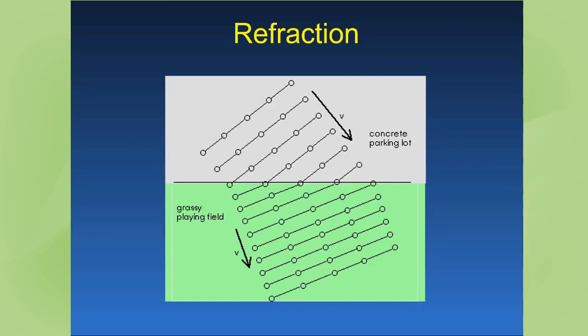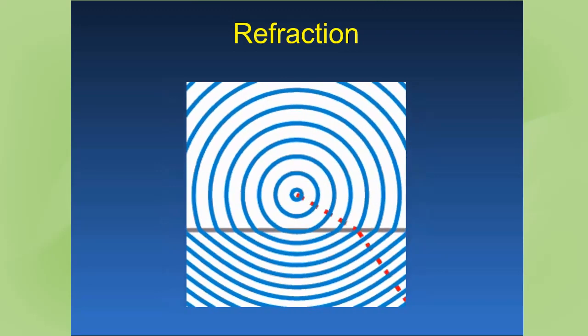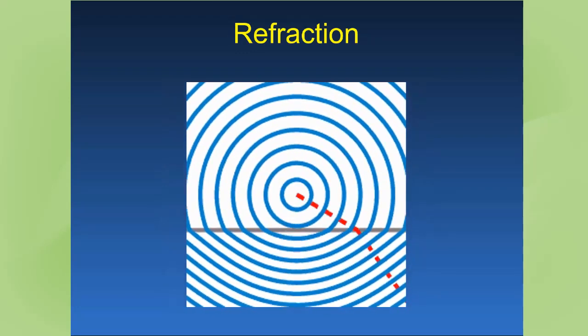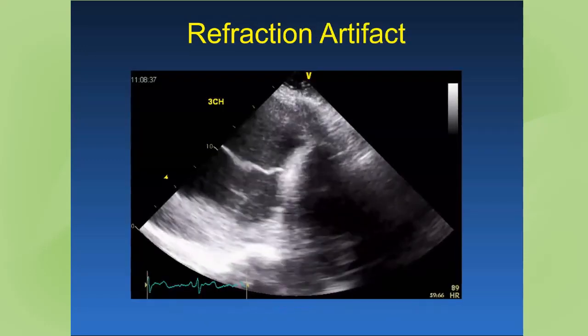And remember that relationship: velocity equals frequency times wavelength. So the velocity slows down, and the frequency, the tempo, is the same. That's constant. So if the velocity decreases, then the wavelength decreases and they get closer. By getting closer, they turn, and that causes refraction. So it's the turning of a wave as it goes through different propagation velocities. Here's that illustration once again: a constant frequency from a source hits a slower propagation velocity, one with more impedance, and then the wavefront decreases its wavelength and actually turns. And so we see two of them, just like we saw two straws.